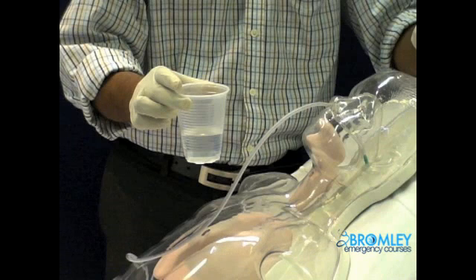As in all procedures, universal precautions are essential. This would include hand washing and donning of gowns, gloves, and goggles.